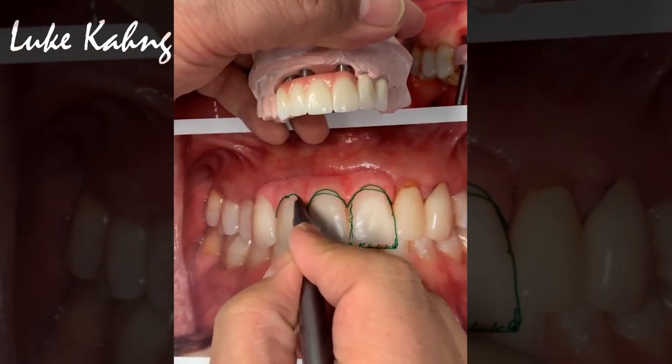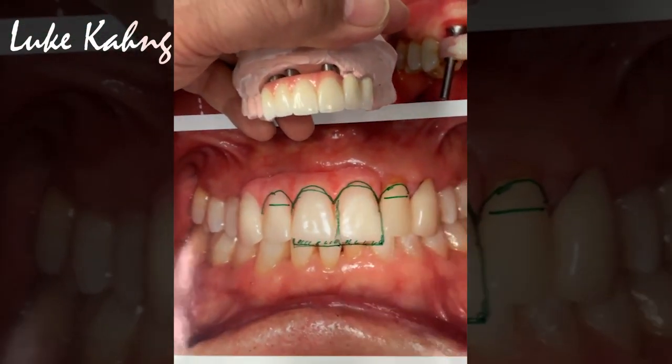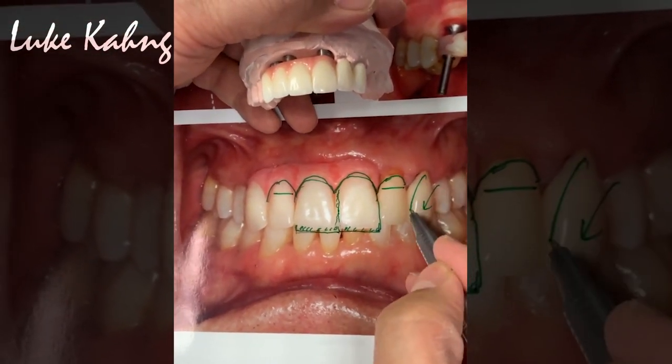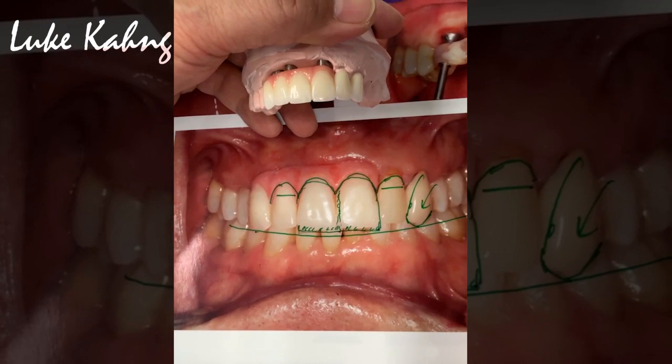Here, this is all types. I make a little bit bigger because I have to make the same height between here. Okay, canine is pretty good. So we make a little bit more cut back here, to make the better shape and contour because of this. Makes sense? So we can all harmonize it.